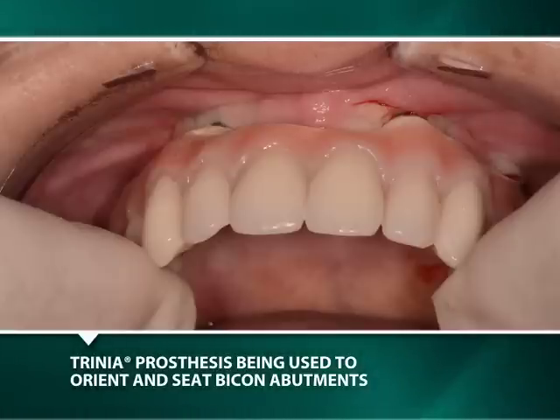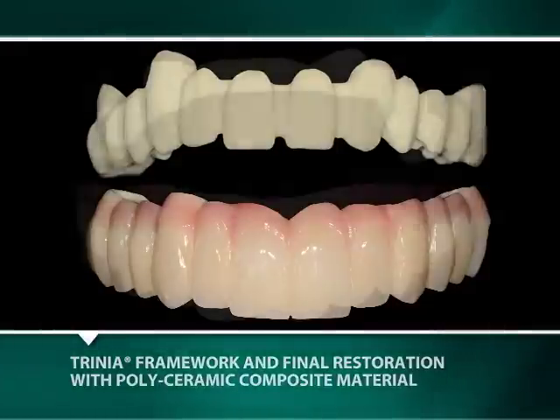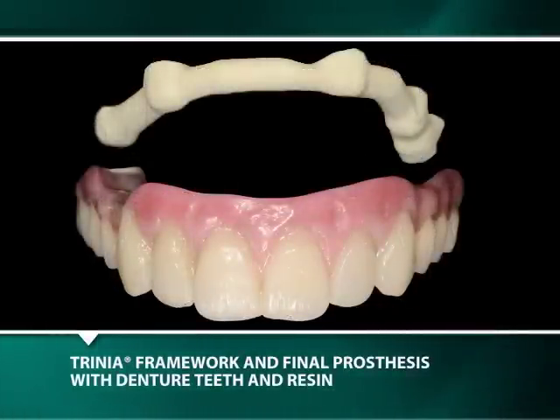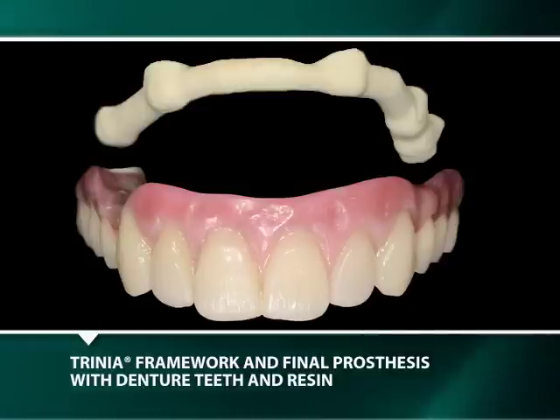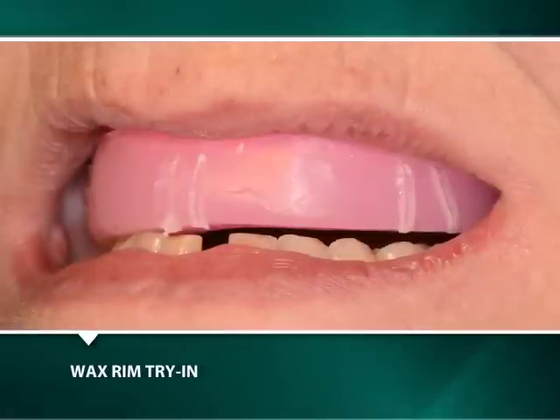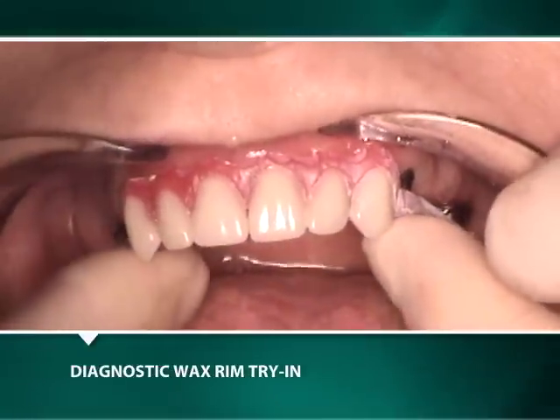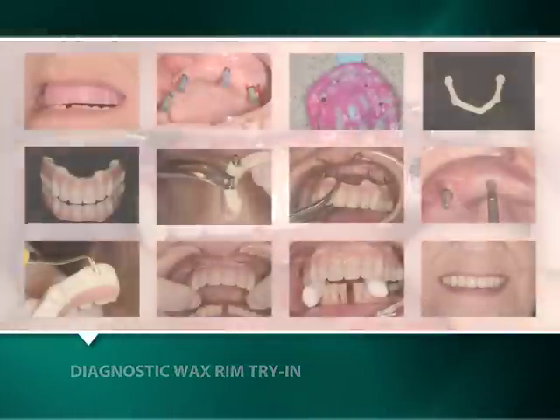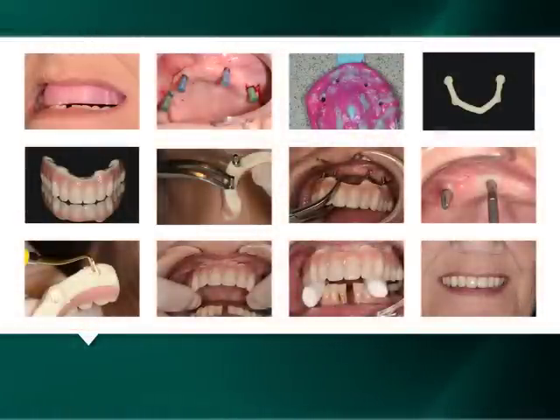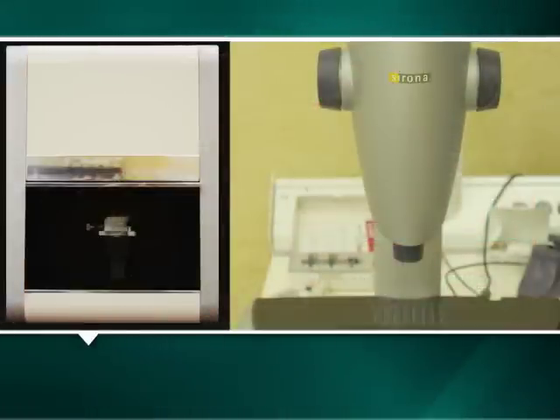The TRINIA framework may be covered with either customized polyceramic indirect composite material or by conventional denture teeth and resin. Regardless of which type of material will ultimately be used to cover the TRINIA framework, it is essential to have an anterior diagnostic positioning, wax rim, or arrangement of the intended teeth prior to the fabrication of the TRINIA CAD-CAM framework. The sequence of the following protocol steps may be altered depending on a given clinical situation. Moreover, alternative scanning procedures may be implemented.